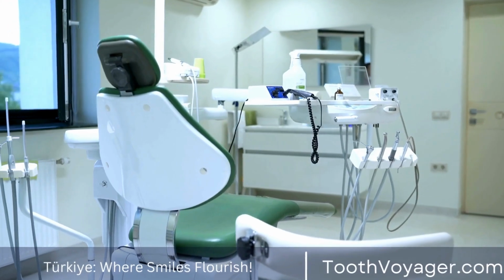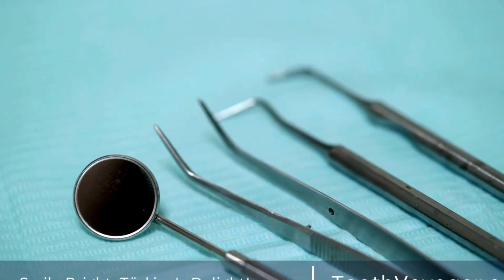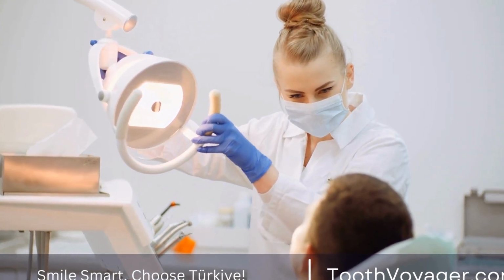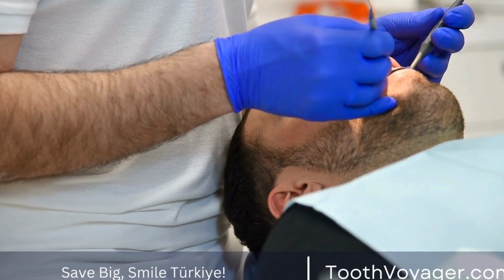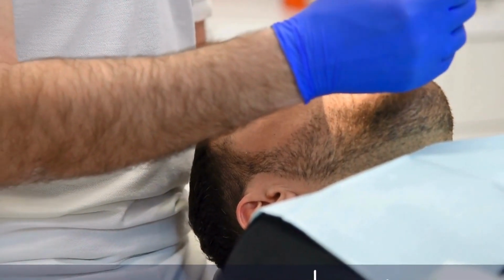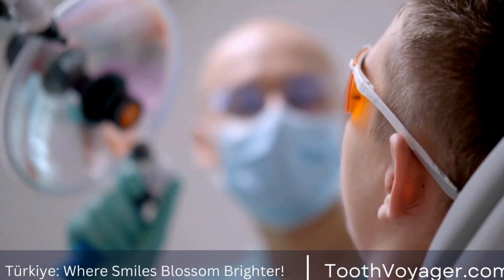Implant placement. When the treatment plan for you is finalized, the next step will be the surgical placement of dental implants. The procedure is generally carried out under local anesthesia so that the patient is comfortable throughout the procedure. The dentist makes an incision through the gums to expose the jawbone beneath and then makes a small space for the implant to be inserted. Dental implants are placed into the jawbone. It is left to heal for 3 to 6 months.